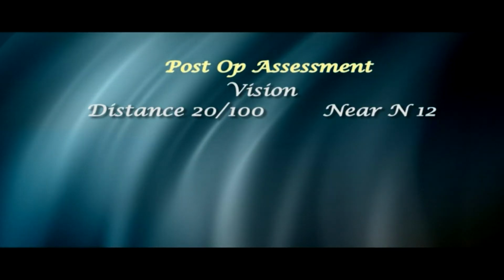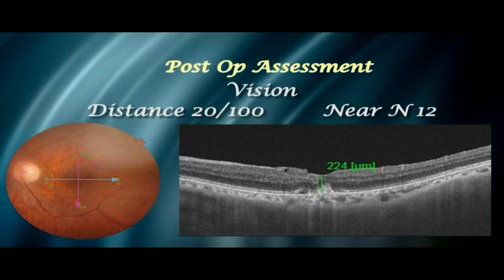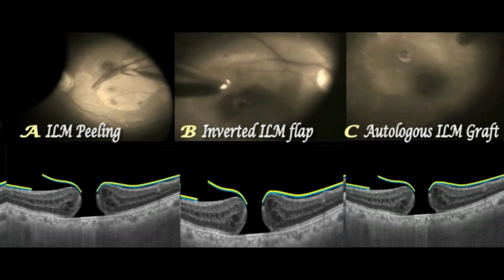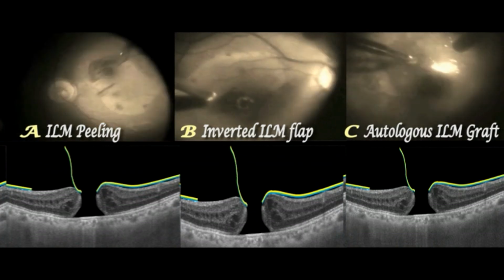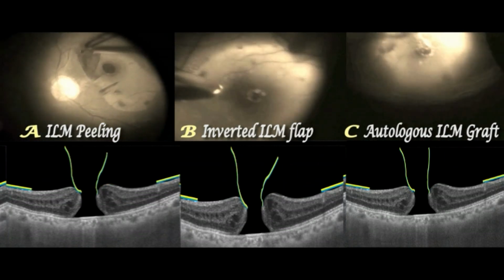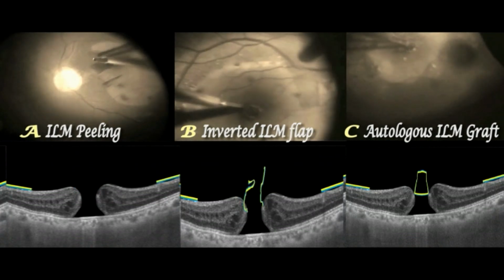Post-operatively, the vision improved to 20/100 and the OCT showed type 1 macular hole closure with 220 micron central foveal thickness. To conclude, our video has highlighted 3 approaches to macular hole repair, including conventional ILM peeling, inverted ILM flap technique, and autologous ILM grafting technique. We have presented here the surgical pearls which a vitreoretinal surgeon should keep in mind when preparing for a macular hole surgery.